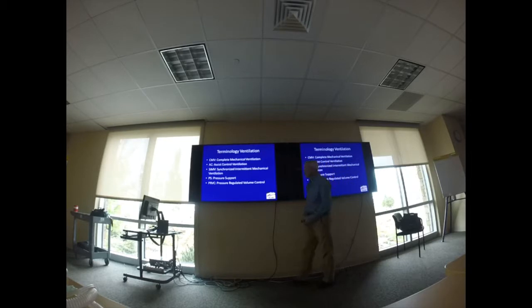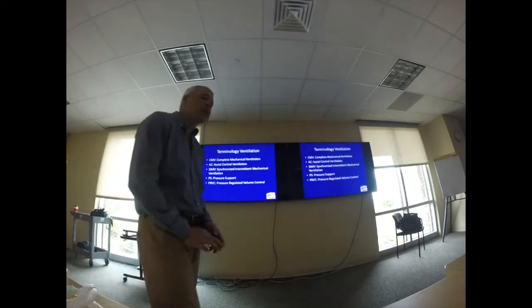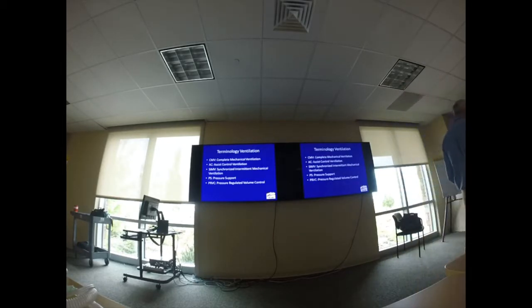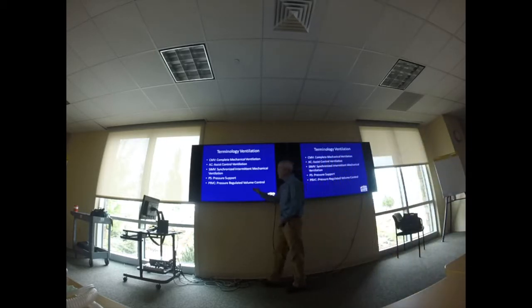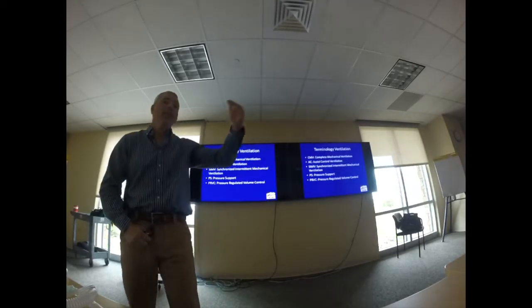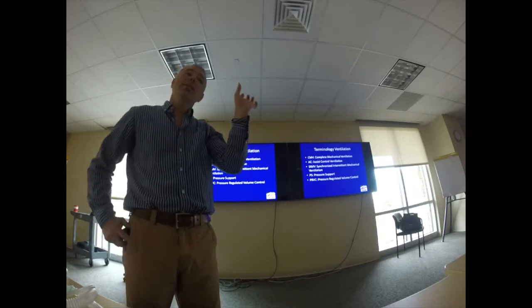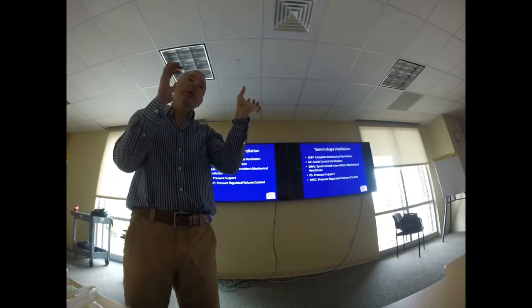Pressure regulated volume control is not a mode of ventilation, it's a breath mode is what it is. And pressure regulated volume control is kind of the best of both worlds. So what it allows me to do is set a volume and a pressure, and then hopefully I'm able to deliver that volume within that pressure, but it's going to regulate it. So it's going to say, man, you got your pressure set at 30 and you want 500, but I'm only able to get in 420, all right?